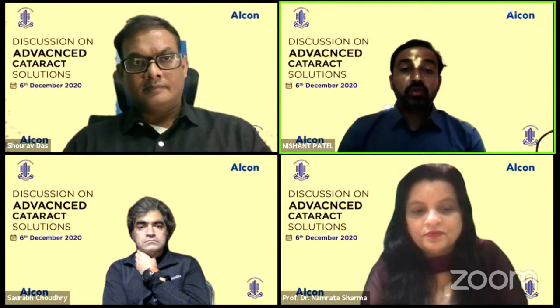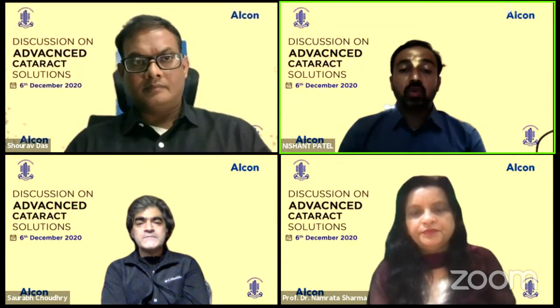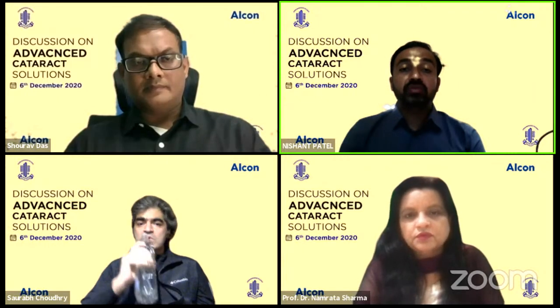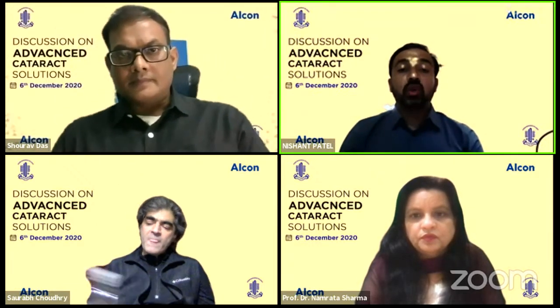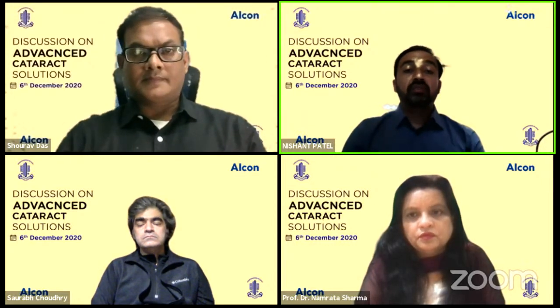This is a wonderful question. Probably this would be the easiest patient to advise because the ophthalmologist himself knows what he is up to and what his visual demands are. As far as the optical quality is concerned, I don't think when you are operating from a microscope, it is going to get compromised too much if you are trying to focus well. The only limitation of an EDOF IOL is that because it's not a single point focus, the sharpness of vision is not there. When you compare EDOF to a trifocal IOL, say PanOptix, the loss of contrast is pretty much the same. So taking out the surgical part, the remaining lifestyle would be much easier with a trifocal IOL.